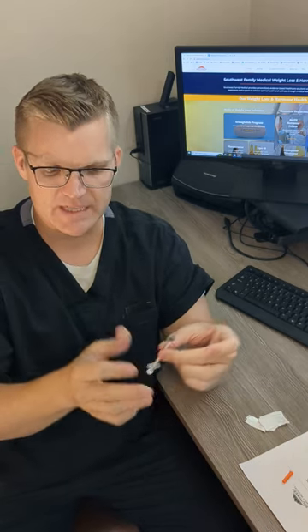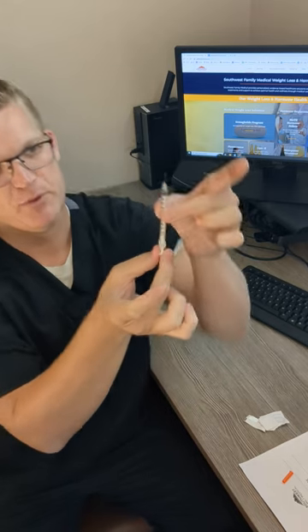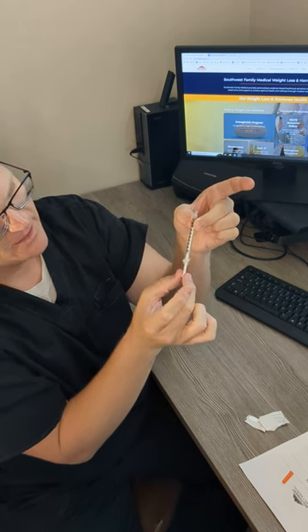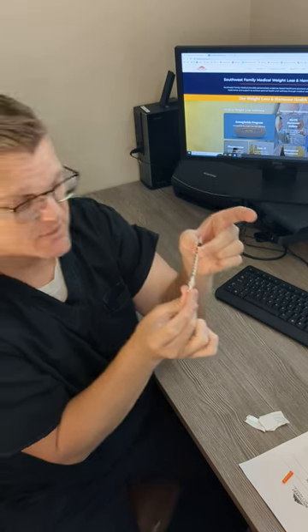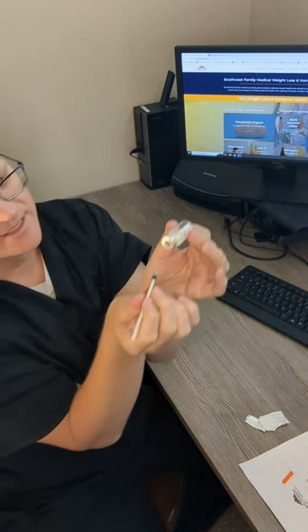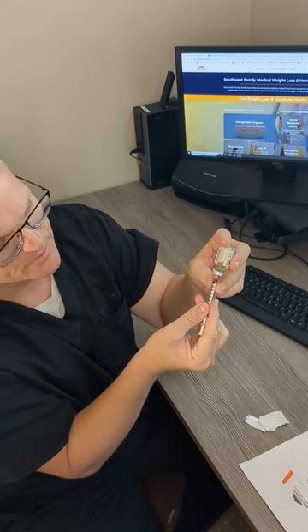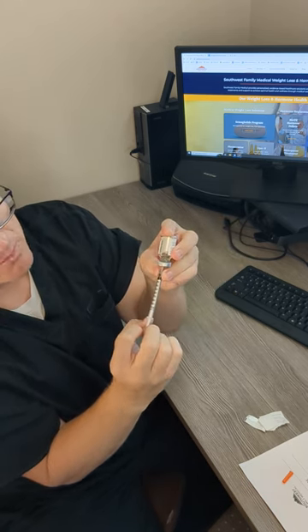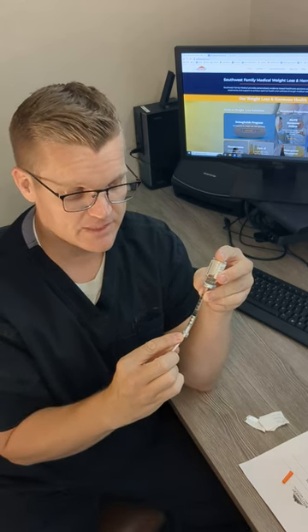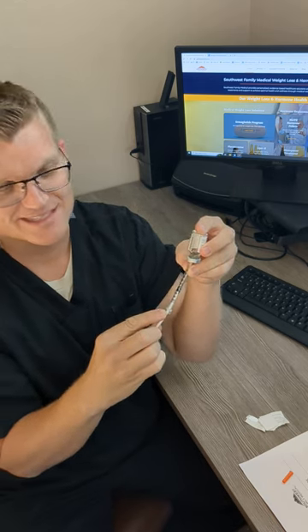Pull the cap off. Now, let's say we're doing testosterone therapy at 50 units — half a milliliter. I'm going to pull this syringe back past the 50. A lot of times it'll move up on itself, but pull back past where your dosage should be. I'll puncture the top right in the middle of the little circle, insert the needle, tip it, and pull back past the 50 to about the 60. If there's an air bubble, tap the syringe — you see that in the movies — and the bubble goes up to the top. Then pull back, let it fill a little more, and push that bubble out. If there's a tiny bubble, it's not the end of the world, but if you're concerned, push it all the way back out and pull back in.